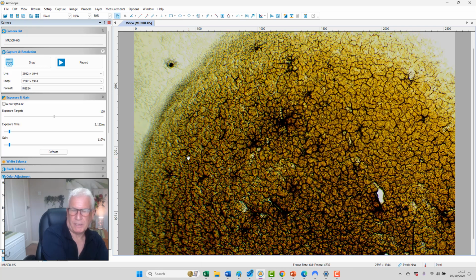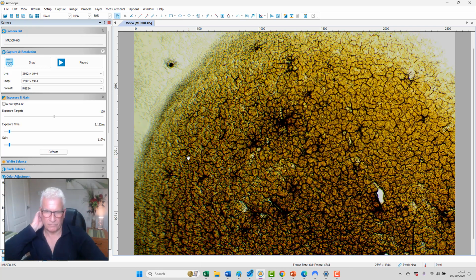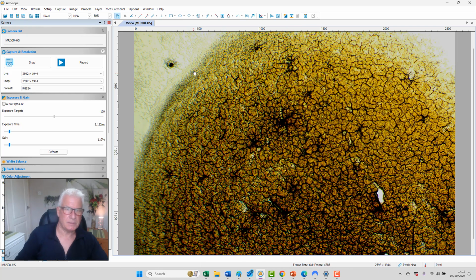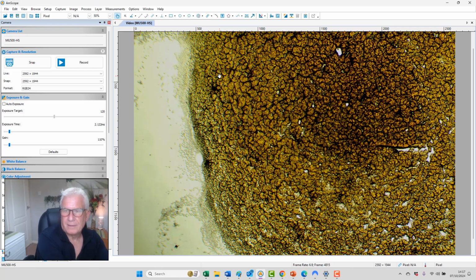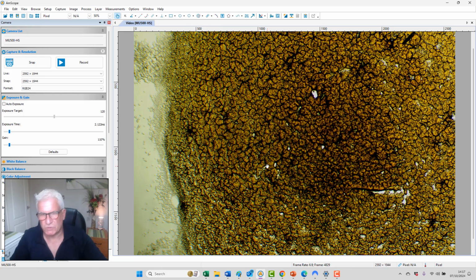We're not going to see the same in every spot, of course. We're looking for an overall picture. Okay, but there's a lot of parasite markers there. All right, one more. Here we go. Oh, there's the structural stress again.